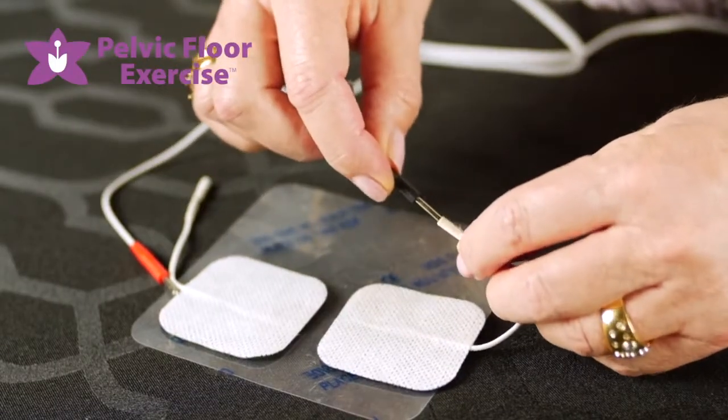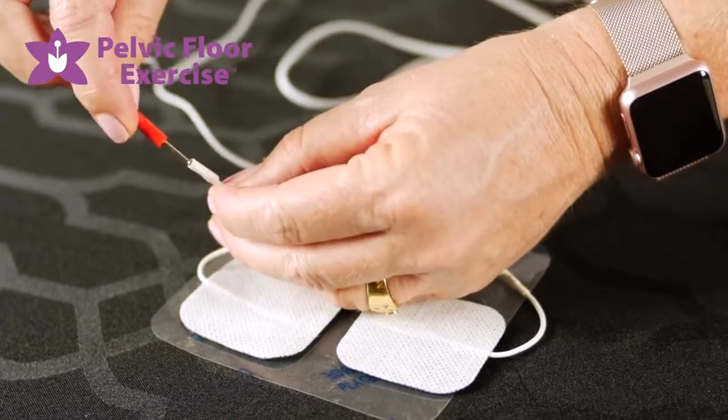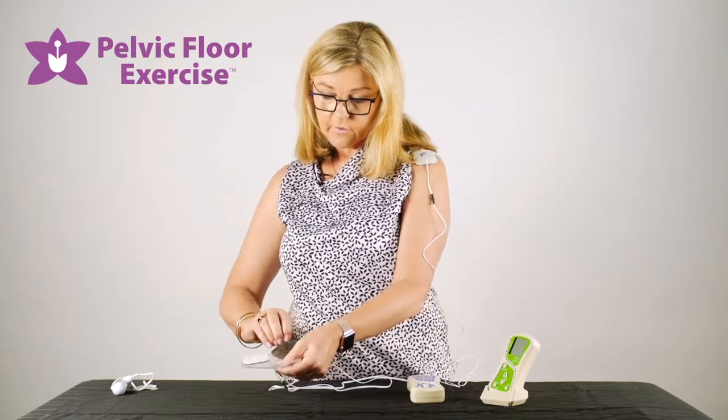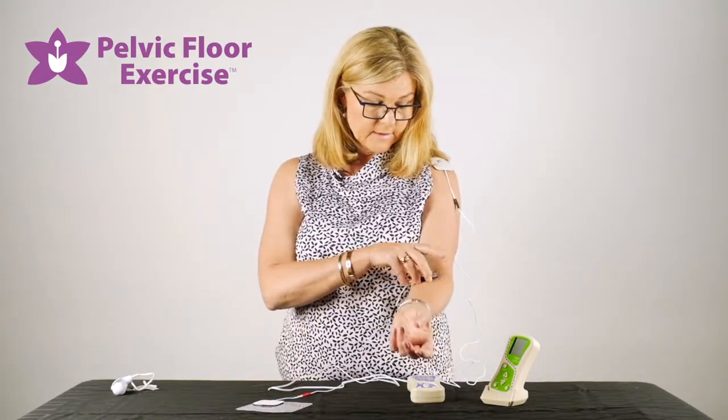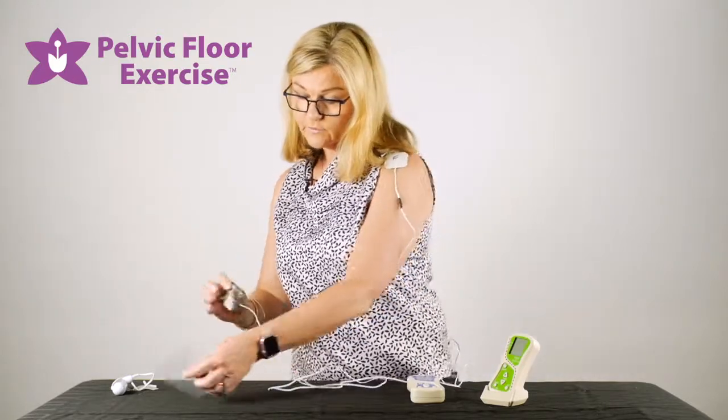We attach our electrodes to the lead, which I've already attached to my machine. Gently peel them off and place them wherever it is you're going to be using your machine.